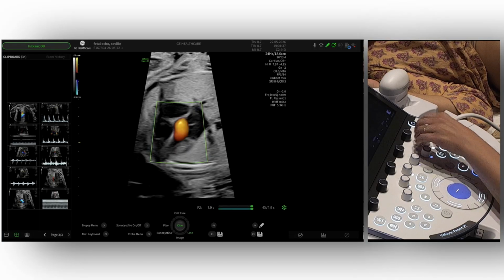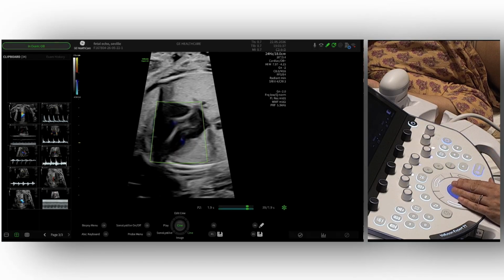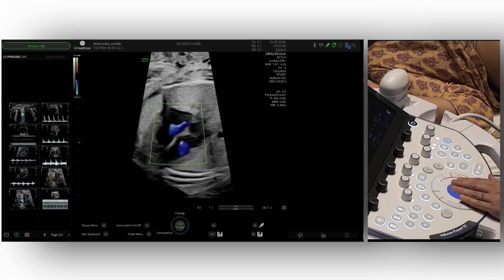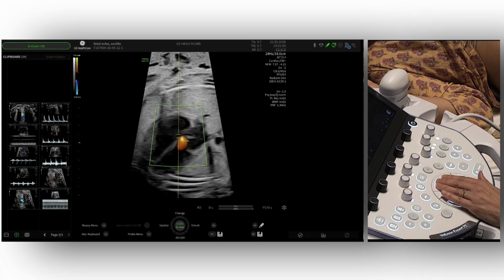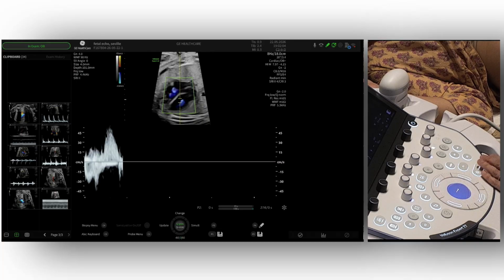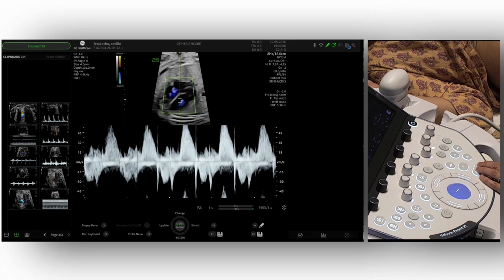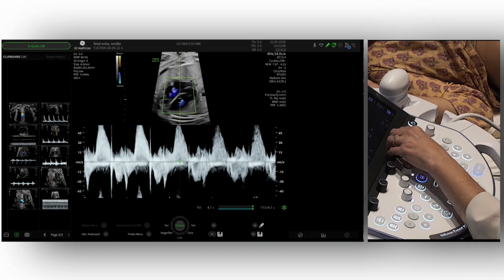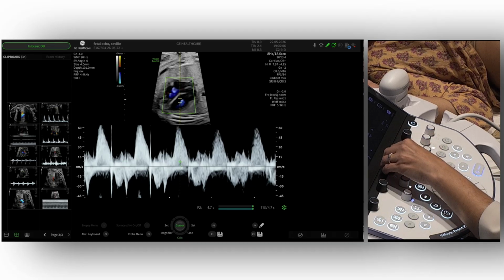If we look at the 4-chamber view, we see here at the same time the inflow in blue, in this case. And then very, very close, the outflow of the aorta in red. That means that they are very close. So if we just go to this part and then go with the Doppler, open the size of the sample volume, we'll be able to get at the same time the aorta and the inflow. So let's try to improve this a little bit.